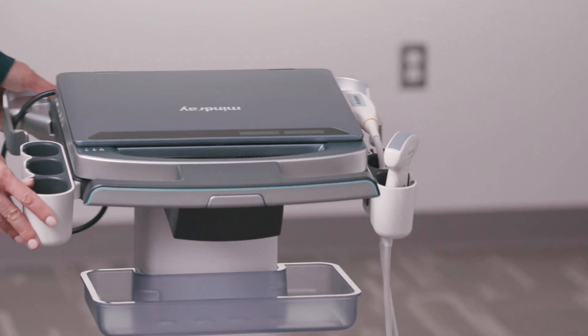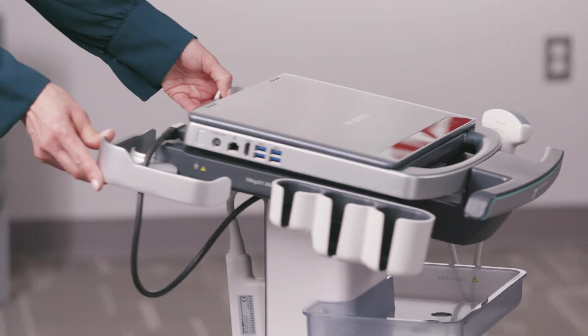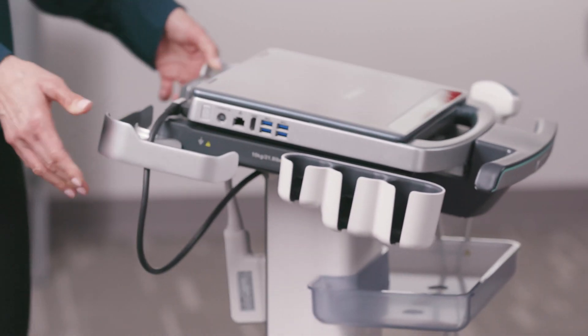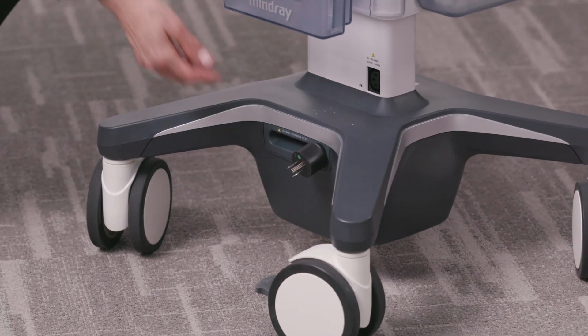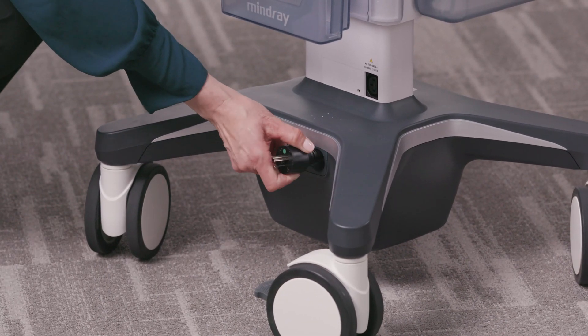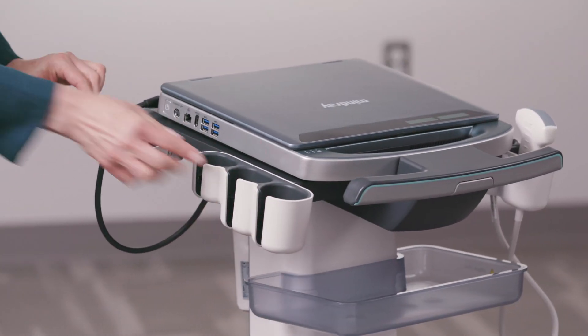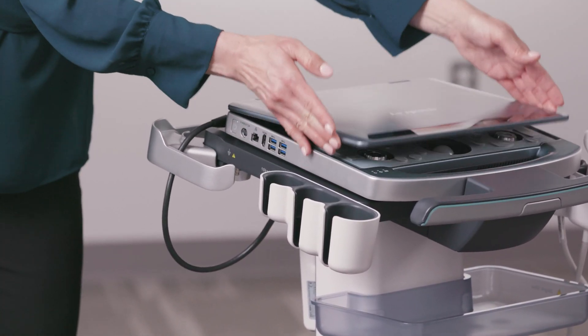If using the MX-7 on a tabletop, plug the magnetic power adapter into the input on the back of the system and plug into a power source. If using the MT3 trolley, plug the cord directly into the power source. Turn the MX-7 ultrasound system on by the power switch on the left side of the system.